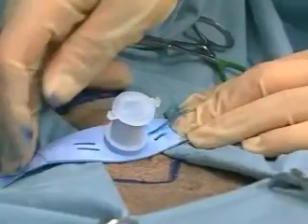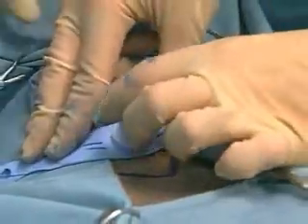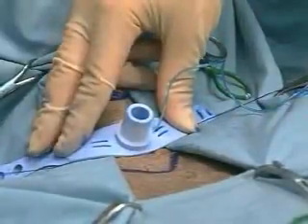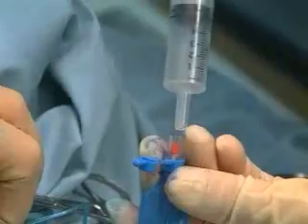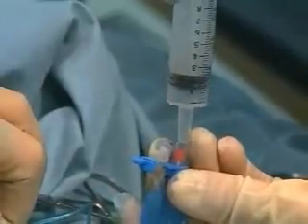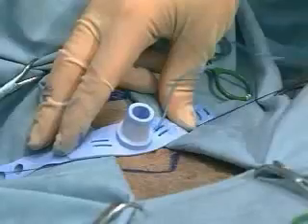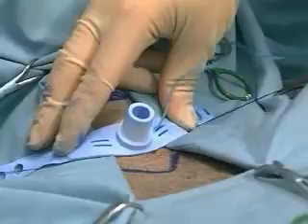If a formal tracheostomy tube is used, it should be inserted to the level of the strap used to secure the tube. It is important to confirm tube position in the trachea by confirming that bilateral breath sounds can be heard in the chest. An end-tidal CO2 detector can be attached to the endotracheal tube or tracheostomy tube to confirm position in the trachea as well. It is imperative that the tube is sutured or held in place to prevent accidental dislodgement, which may be fatal.